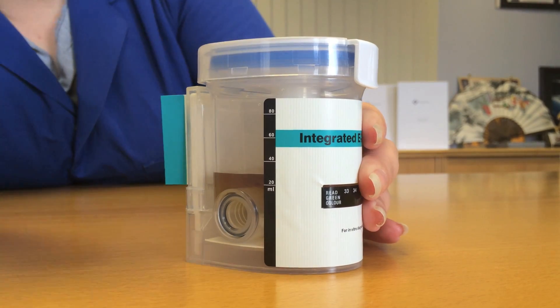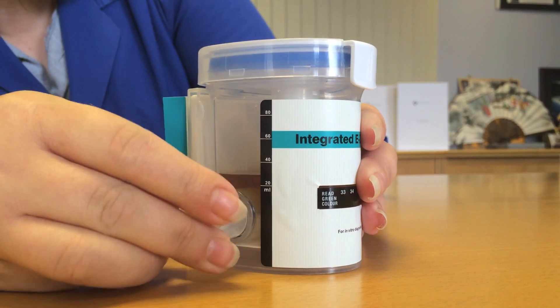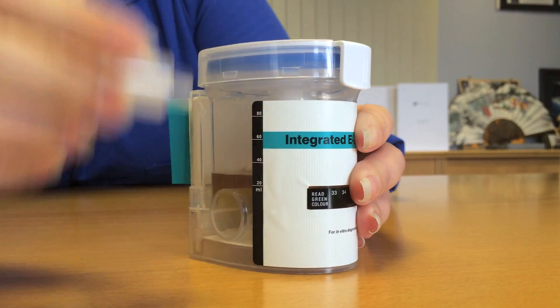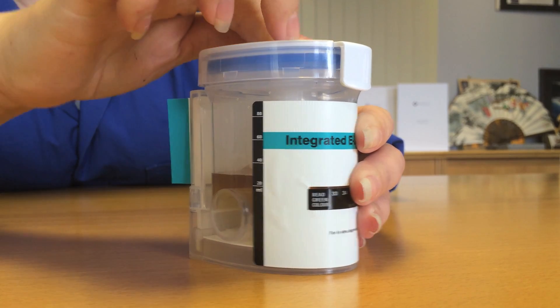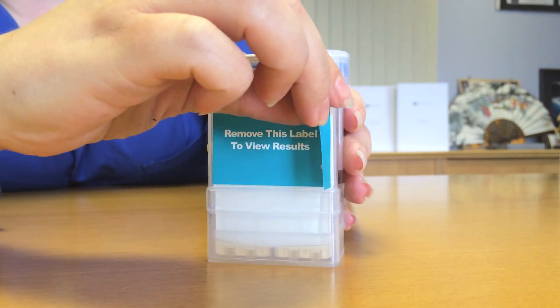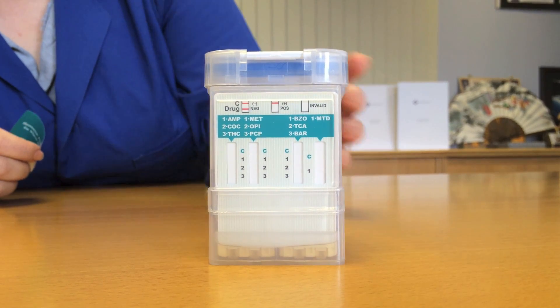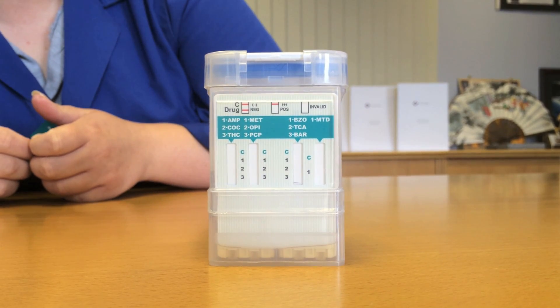Take the key from the lid and slowly push it into the side chamber as far as it will go, and then return the key to the lid. Remove the sticker from the back of the cup to show the test strips. Wait 5 minutes and then read the drug test results.